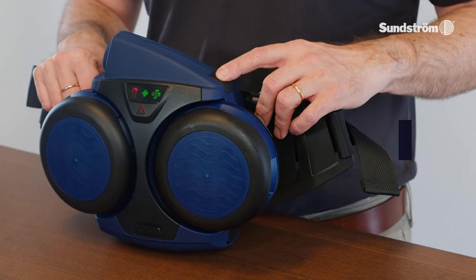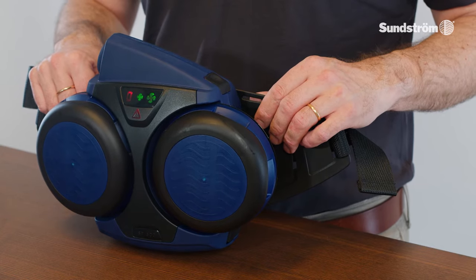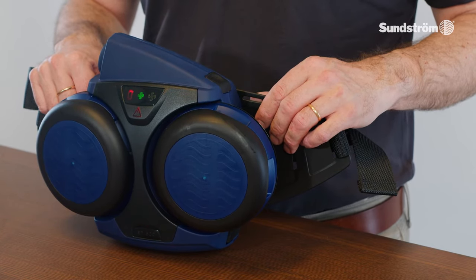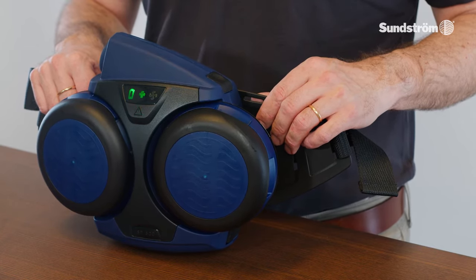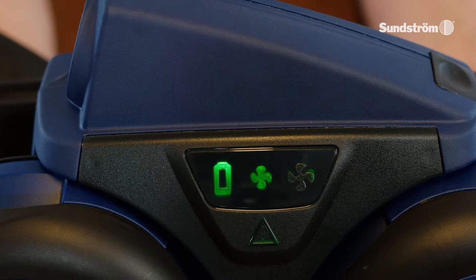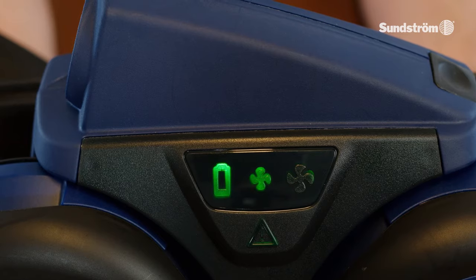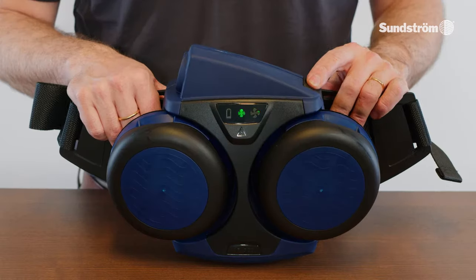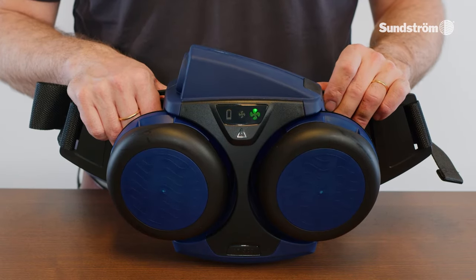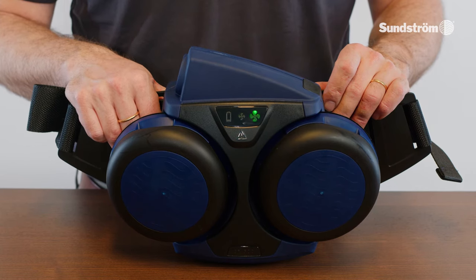Operation, performance. Start the fan by pressing the control button. A programmed test will be run on the fan; the audible signal will sound and the vibrator will vibrate twice. The fan starts in normal operating status at 175 liters per minute. If the button is pressed again, the flow will increase to 240 liters per minute and the large fan symbol lights up.